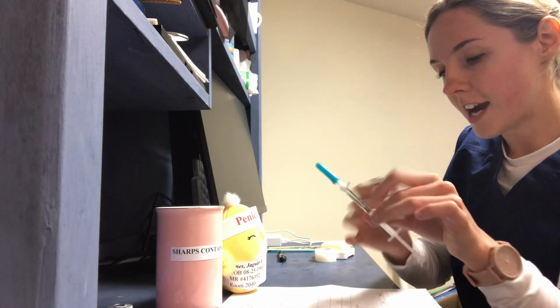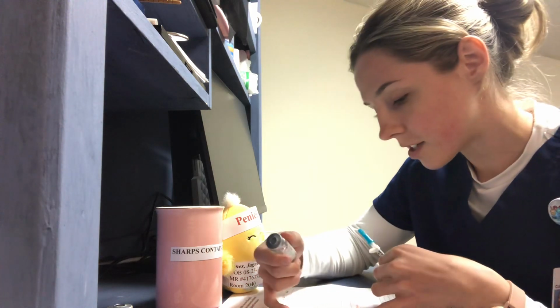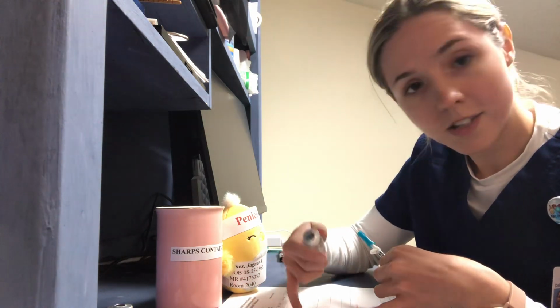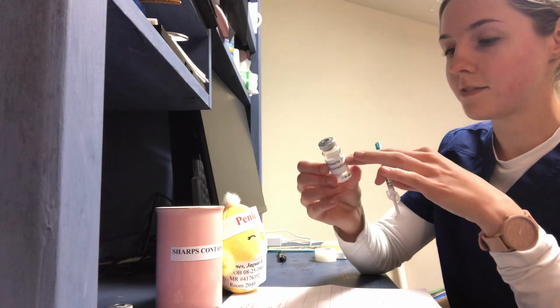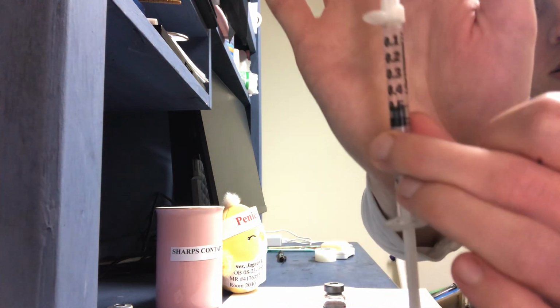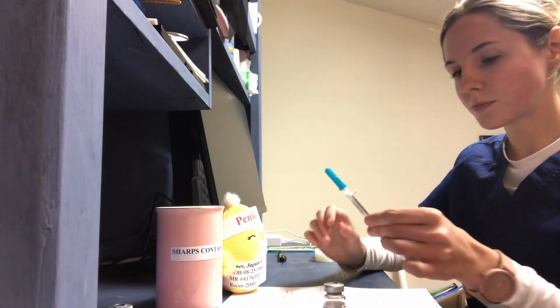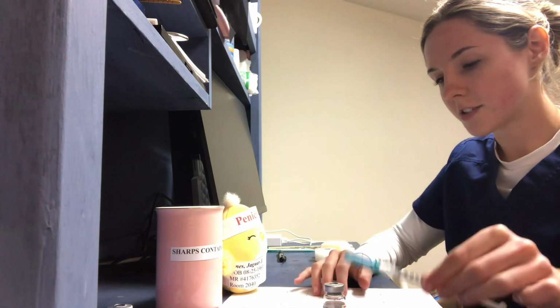Now I'm double checking. I have 1/2 milliliter of solution. I need 1/2 milliliter of solution to get that 5,000 units in the chart because I have 10,000 units per milliliter in my vial. So I'm going to show you this. I have half a milliliter of solution, no bubbles. All right, that looks good.